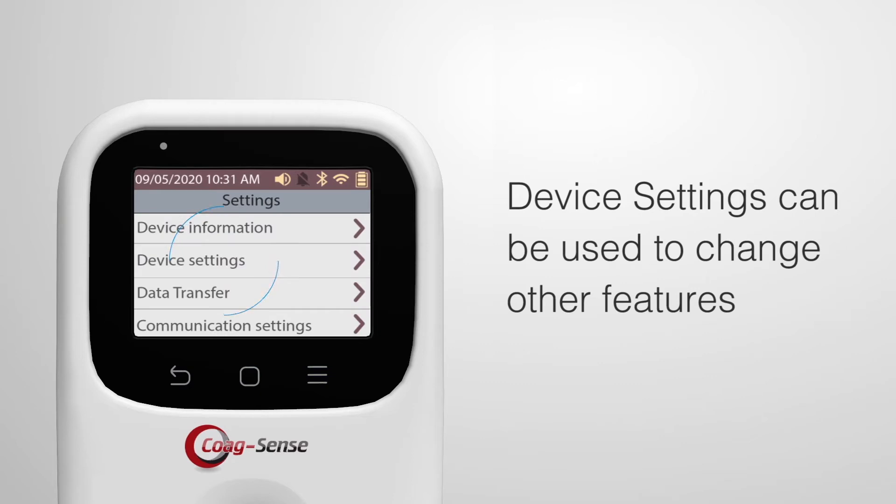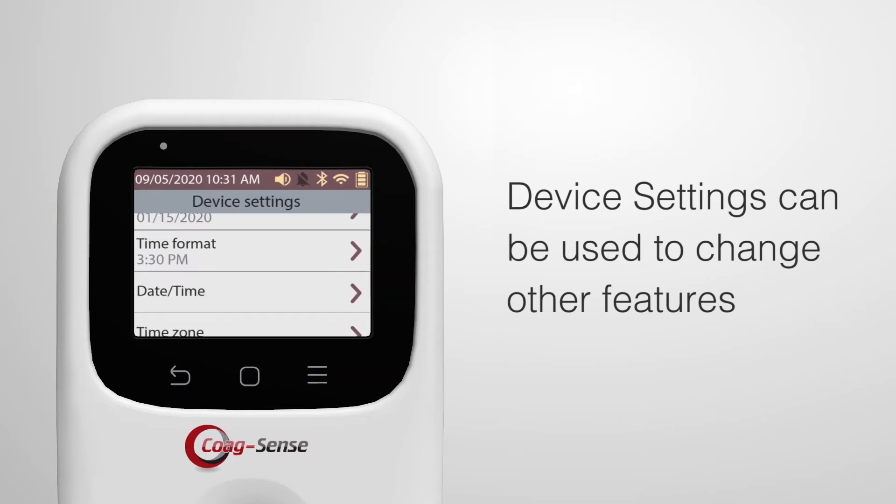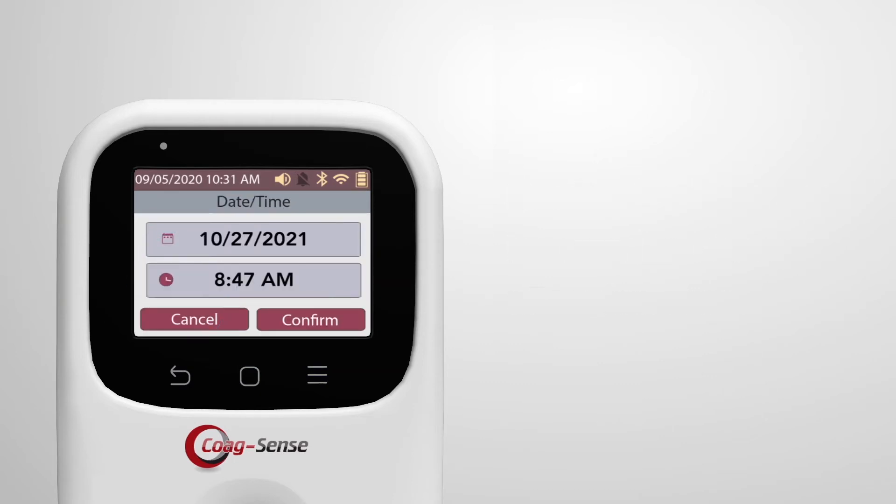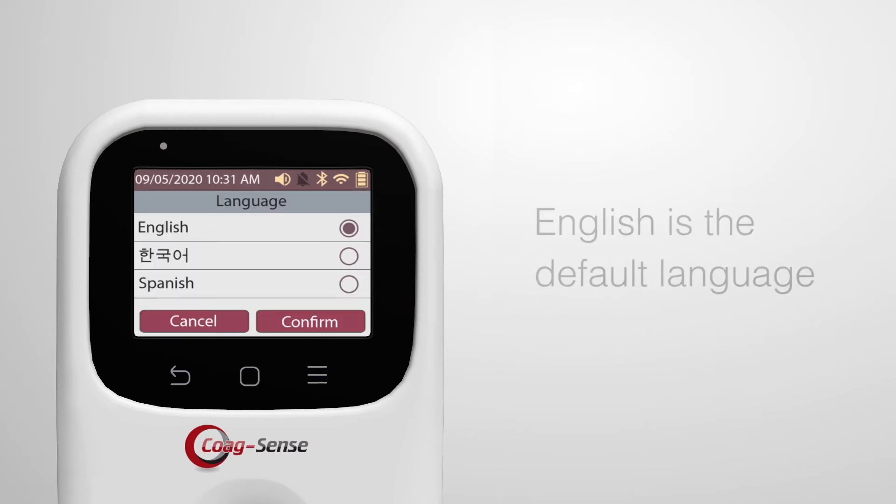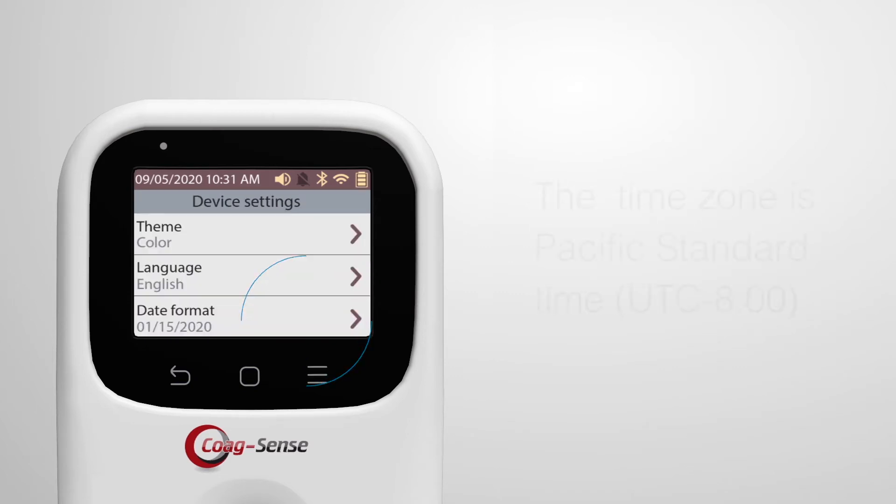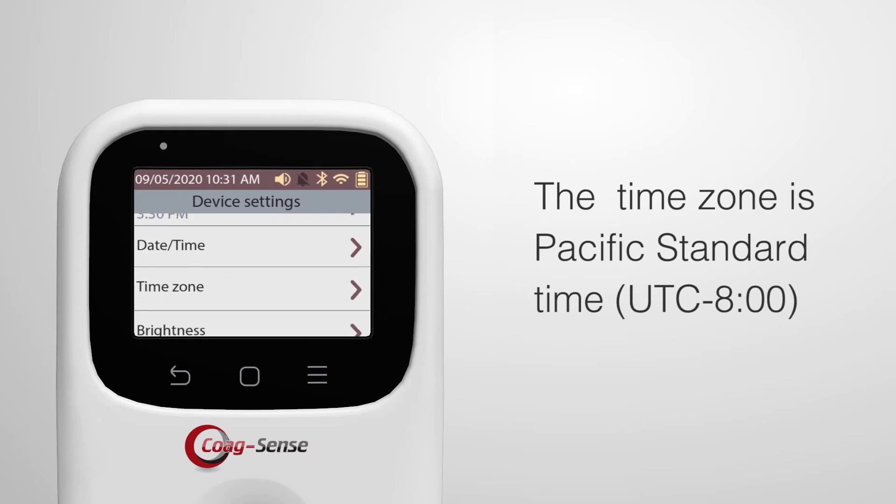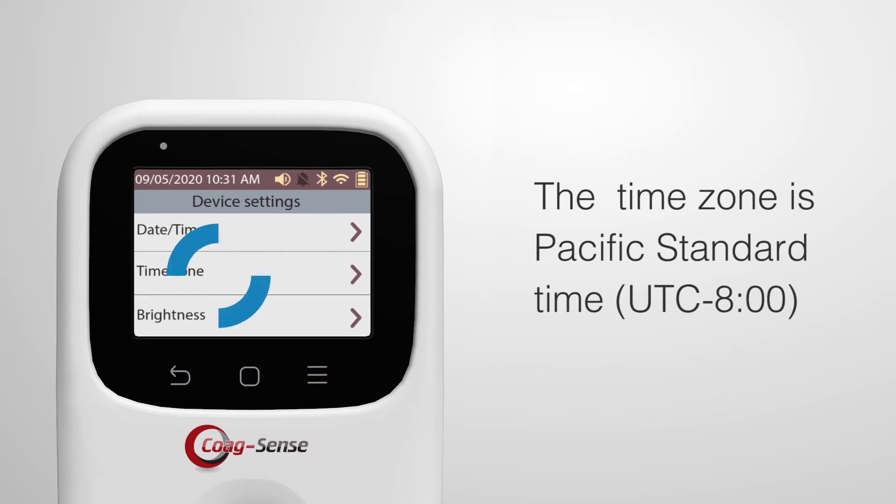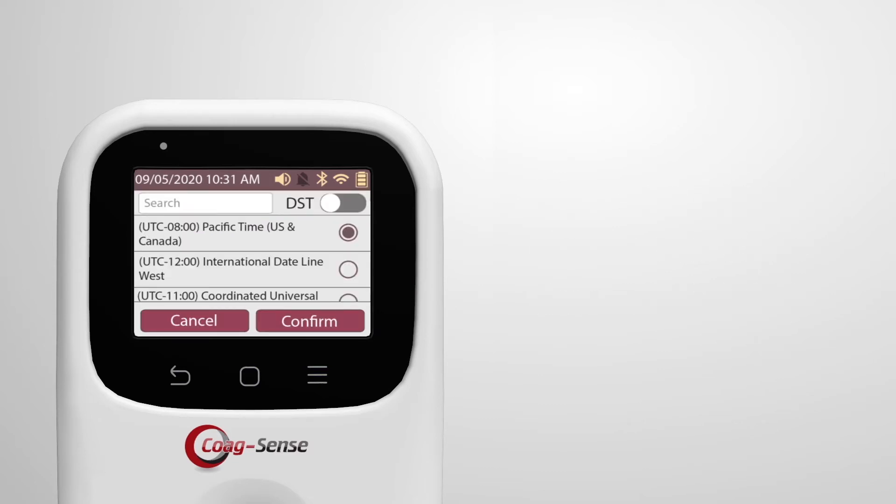Device settings can be used to change other features, such as date time. The meter is sent to default factory settings. English is the default language, and the time zone is Pacific Standard Time, UTC minus 8 o'clock.